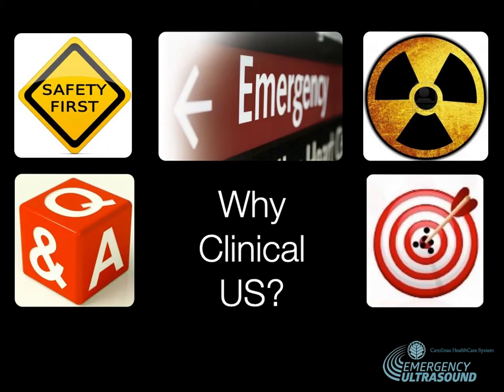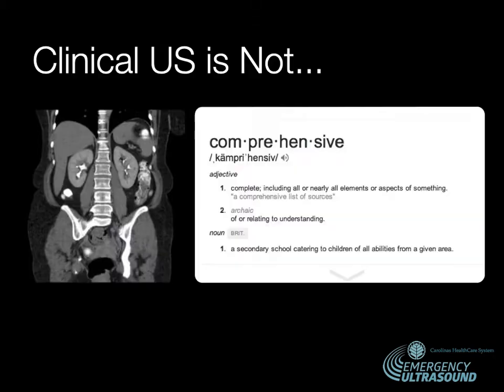Other reasons that we use ultrasound are that it's actually a pretty safe imaging modality. There's energy transfer, but there's no associated radiation. It can be safely and usually pretty quickly repeated on patients if there is a change in their condition.